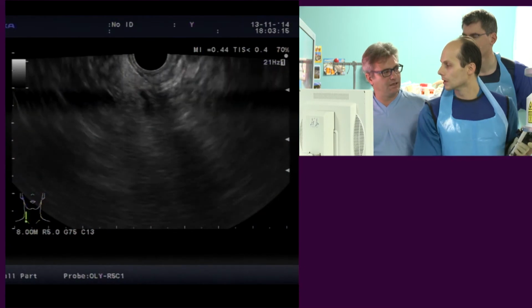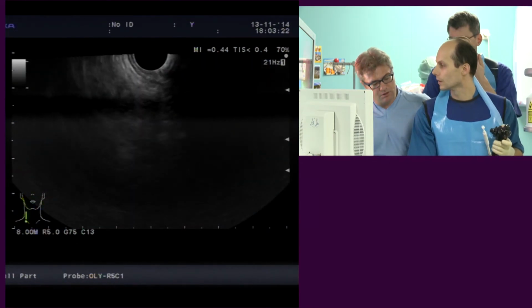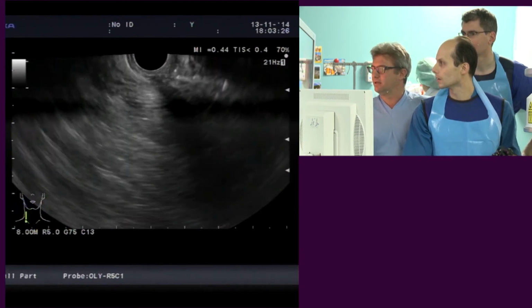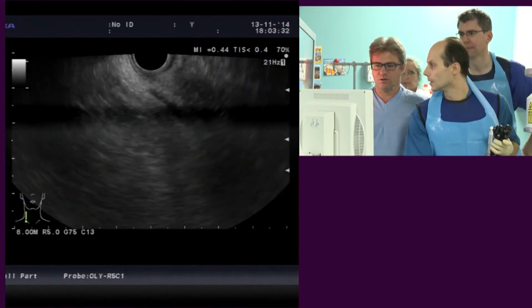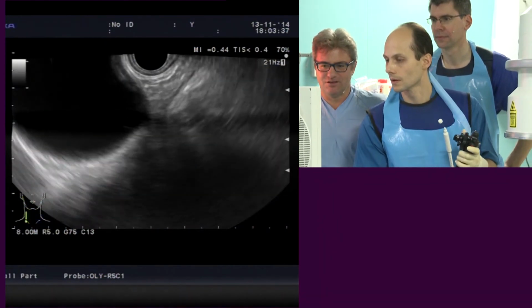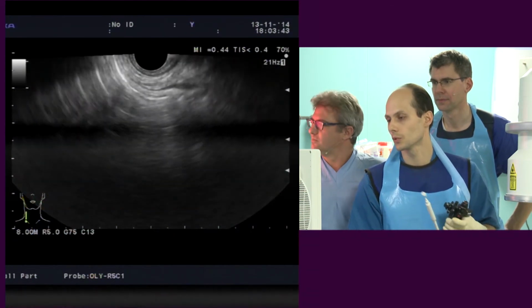And you can see it in the endoscope. This is a 22 gauge needle, and there's a lateral opening, and yes, it's out. So it's not going to puncture the scope. That's good. Is that a stone, or I think it's just a shadow, maybe from air.